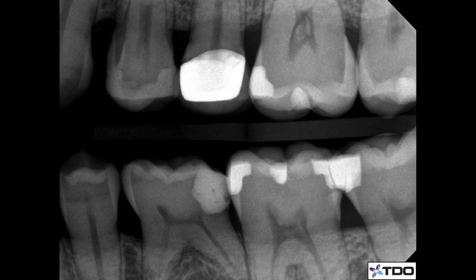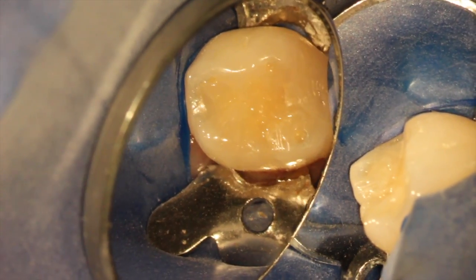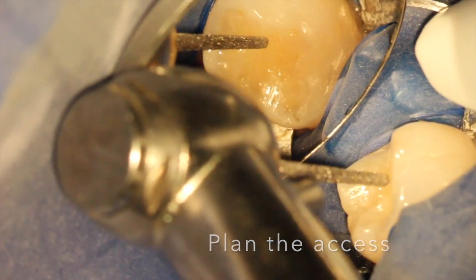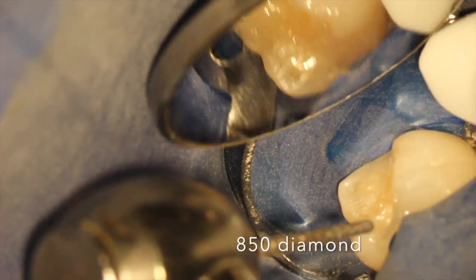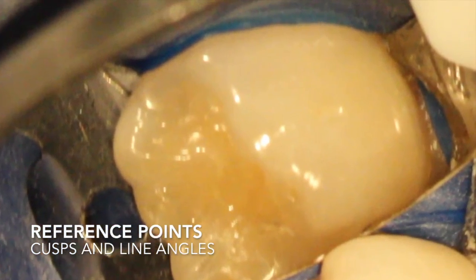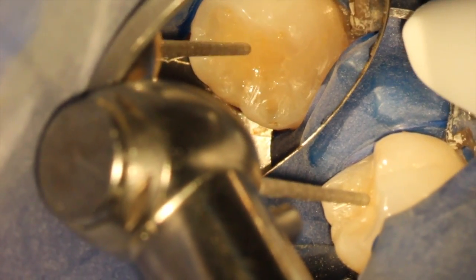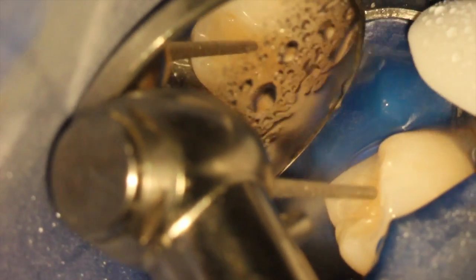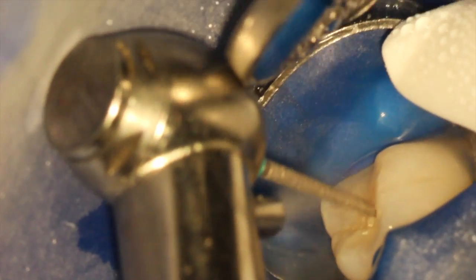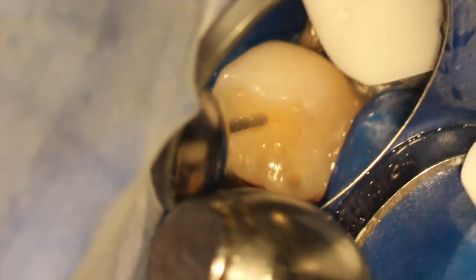She developed symptoms, and radiographs along with a lot of discussion with the general dentist led us to going for a root canal and trying to keep it. You can see occlusally there are some wear facets, some clenching and grinding. I use the microscope and rubber dam to plan out my access. The reference points are the cusps and the line angles at the gum line — those are my external boundaries as I go into the access three-dimensionally.